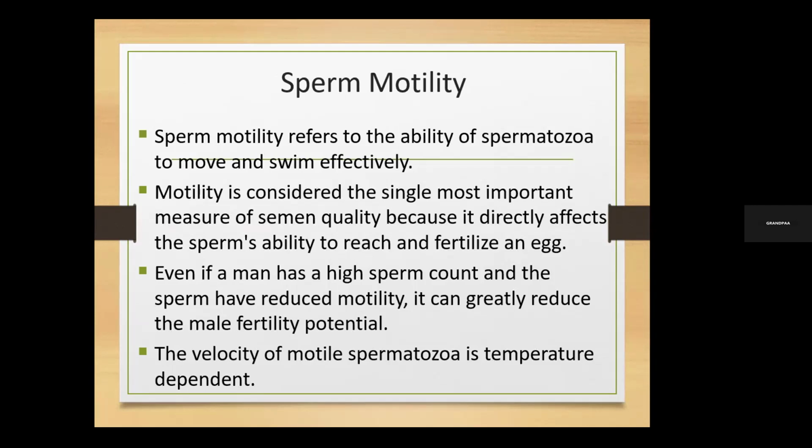It is said that the specimen can be kept in your pocket, close to the body. If you have a jacket, put the jacket on, just to keep it as warm as possible.